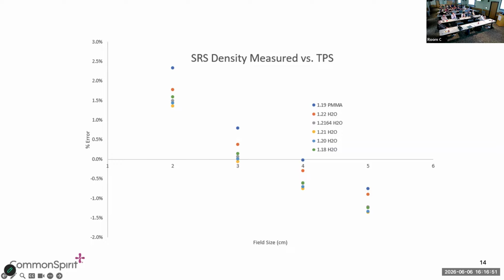Currently, I have a program called ClearCalc. I don't know if people are familiar, but I used to have RadCalc. And in RadCalc, they say alpha all the time, like on the bottom left or something. And so I'm just going off of historical values of what I was seeing on IMRT QAs. And the general thing was an average leaf pair opening through the modulation of about 3 cm. So I essentially zeroed out the SRS and the ArcCheck to be at about 3 cm.